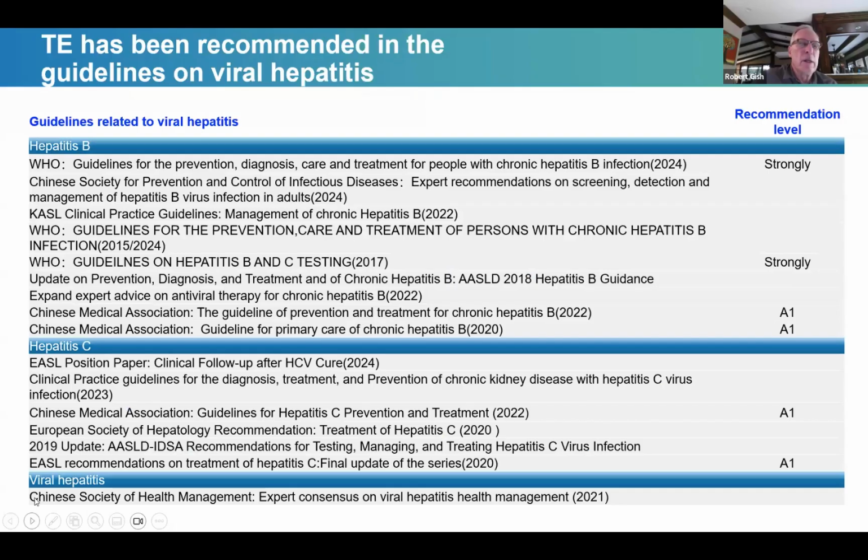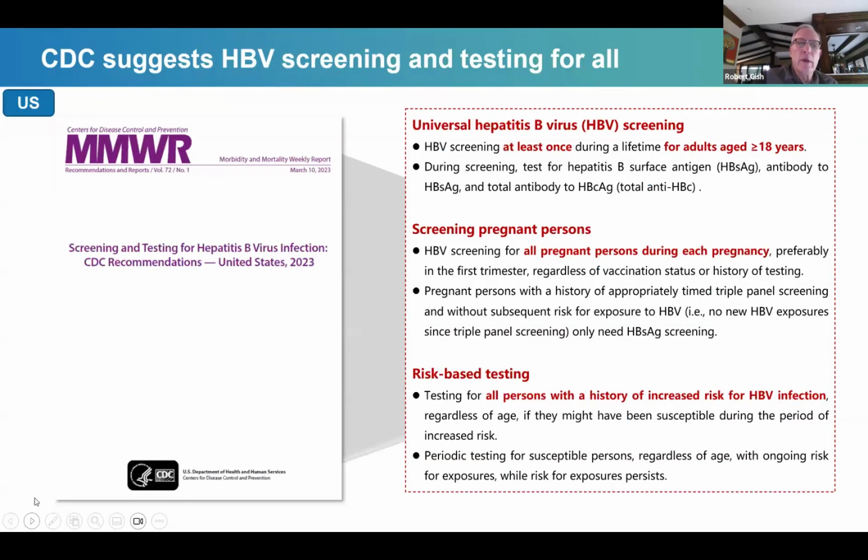Very encouraging. And this is where transient elastography has been listed in different guidelines. And of course, the slides and all this data will be available offline after this presentation. If you need more information, the recommendation level is high, designated on the right side here.